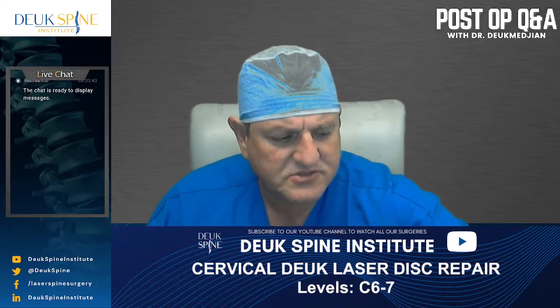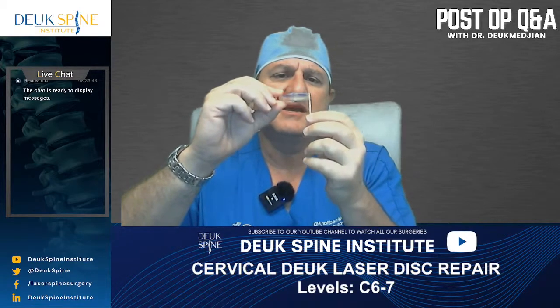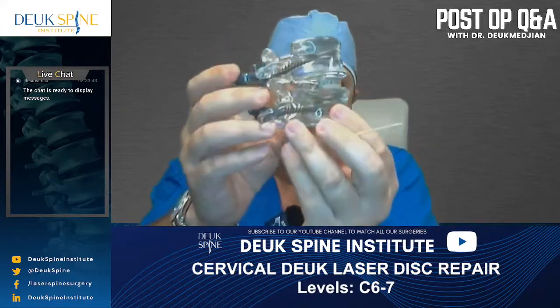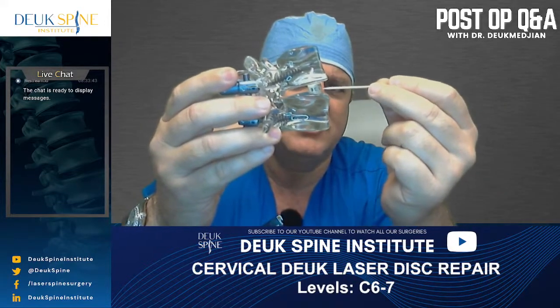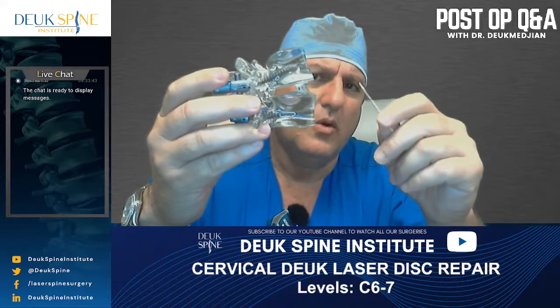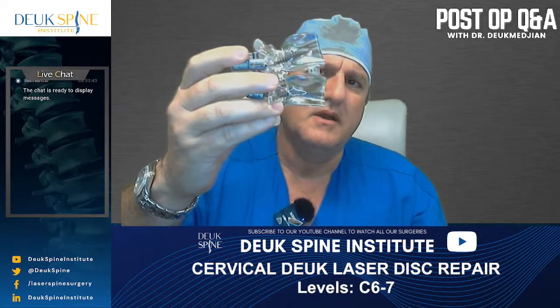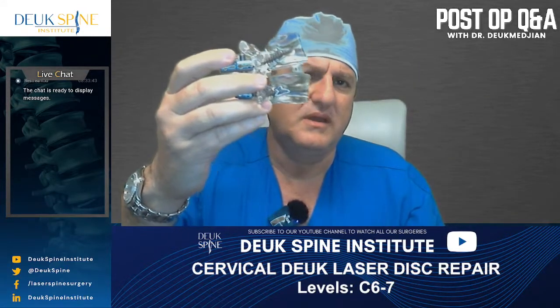Now, surgeons who do fusion surgery like anterior cervical discectomy and fusion, to get to this herniation in the back of the disc, they're going to take your entire disc out. And when they take your entire disc out, let me just show you what that looks like. When you take the disc out, there's nothing in between the bones but space. So those surgeons have to put a cage that's solid. It's made out of PEEK, which is polyether ether ketone. It's a synthetic carbon. Or they put metal, or they'll put cadaver bone, like a dead person's shin bone that's been milled and cut and sized to fit in there. So who wants a cage or a piece of titanium or cadaver bone in your spine?